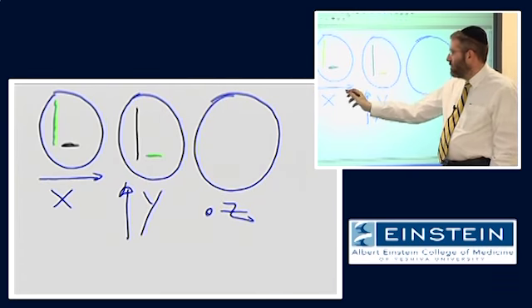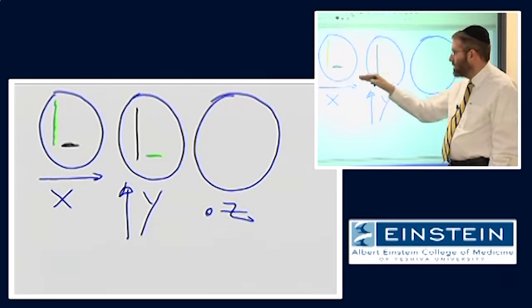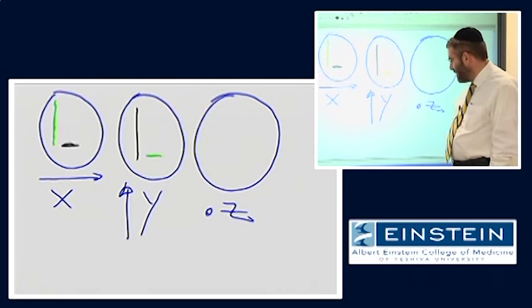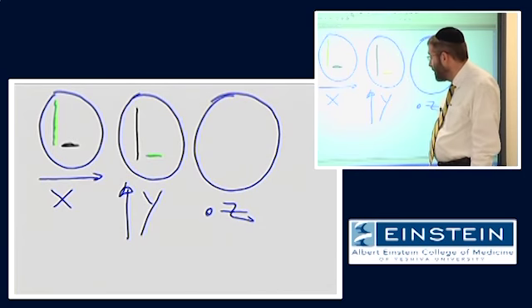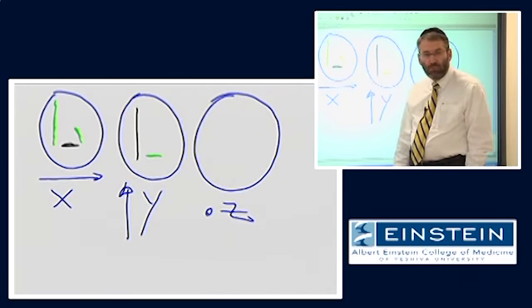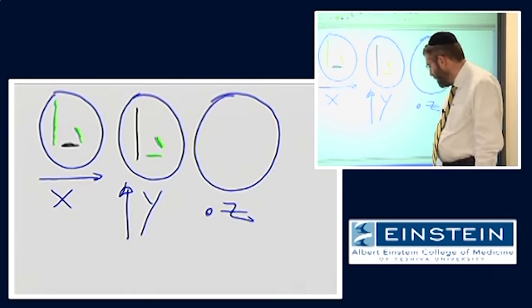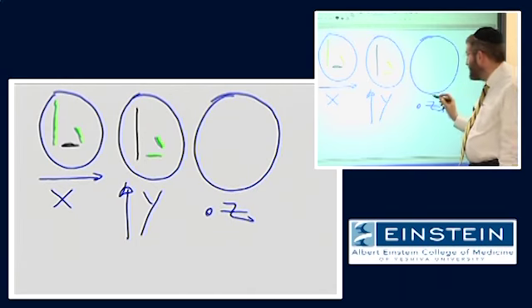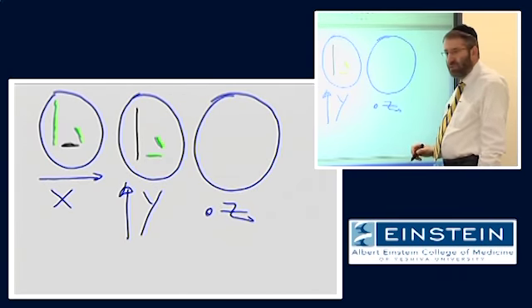So what would diffusion in the internal capsule look like if we sensitized on a left to right direction? It would be relatively high signal. Right? What about over here? Same thing. And in this image, where would we have our lowest signal?